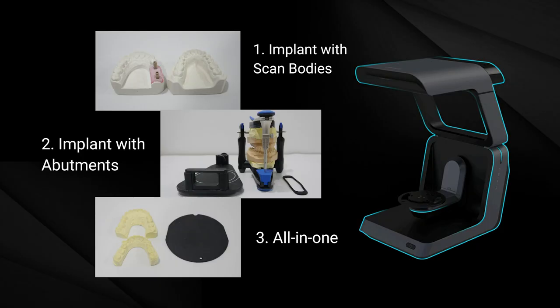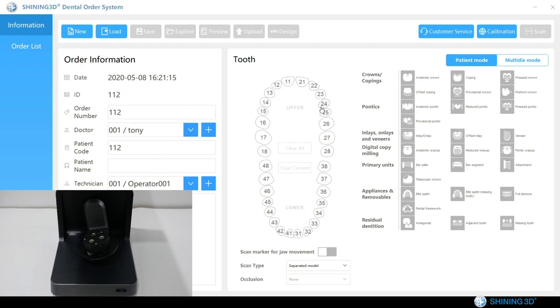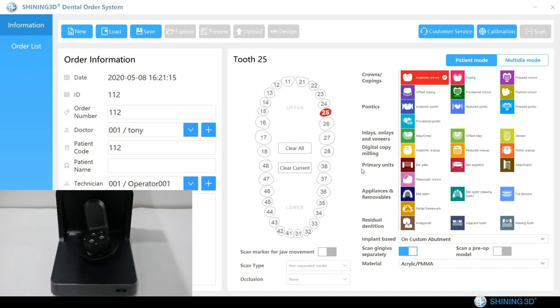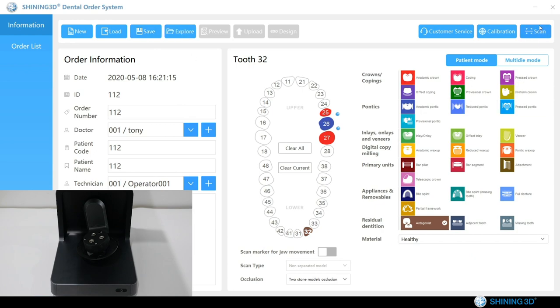Okay, let's start from the first case. Just double click to run the software, Dental Manager. On the left side, we can fill in the information of this case. In the middle, we can define the tooth number, 2-5, anatomic crown. We select a custom abutment, 2-6 pontic, 3-2 anatomic. Okay, 3-2 should be the antagonist. Click save, then click scan.